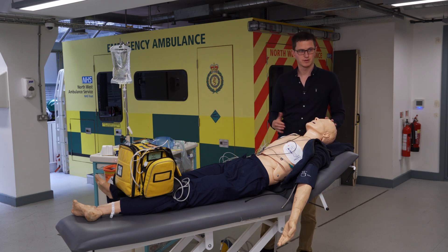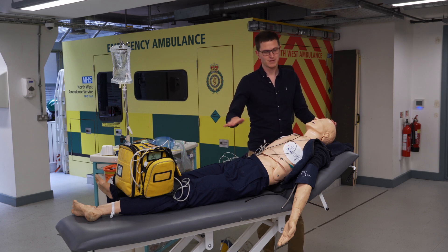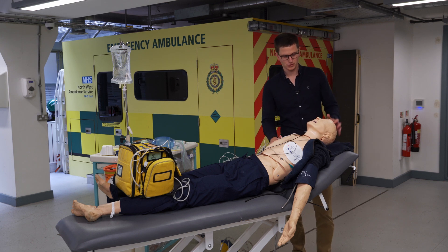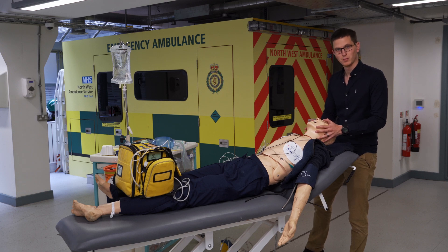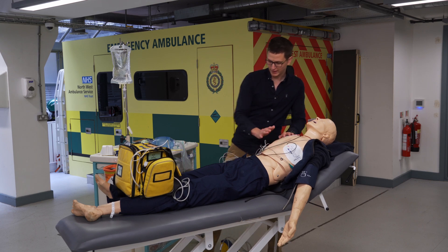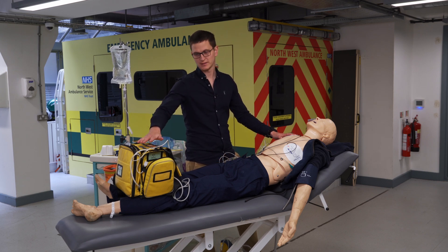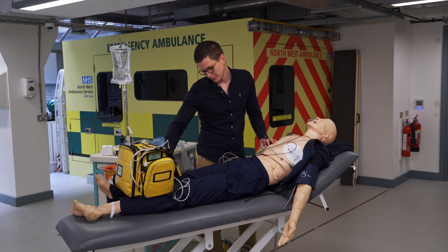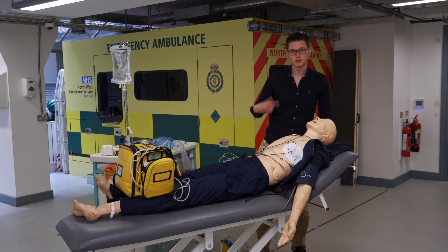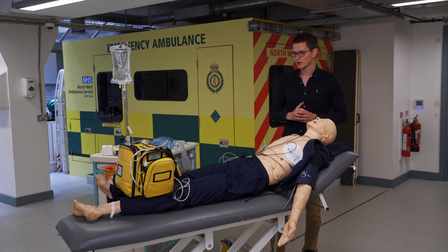Let's prepare the patient. We want him positioned correctly in the semi-Fowler's — head up a little bit — for good ventilation and a good view, and to bring him to the right height for intubation. We have pads on in case he goes into cardiac arrest. We have our four-lead on, SATs probe on, and two IV lines. Monitors are all attached with capnography and a BP cuff. I'd recommend setting the blood pressure cuff to cycle automatically every three minutes for a continuous up-to-date reading and better trending.